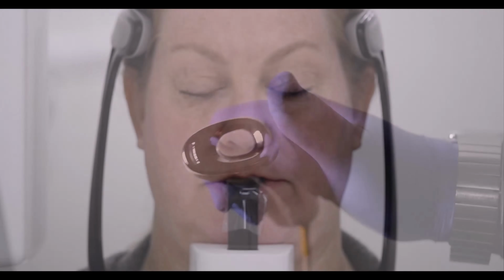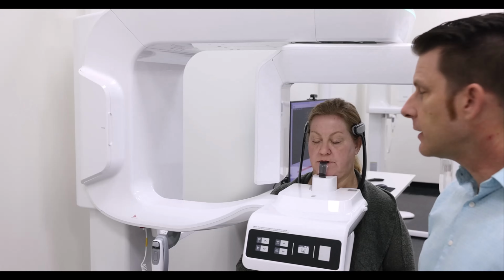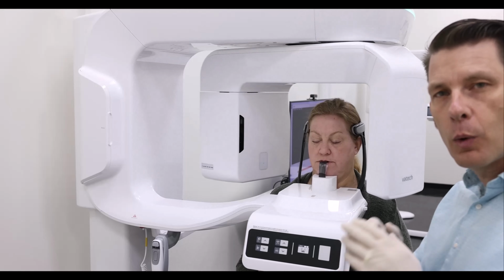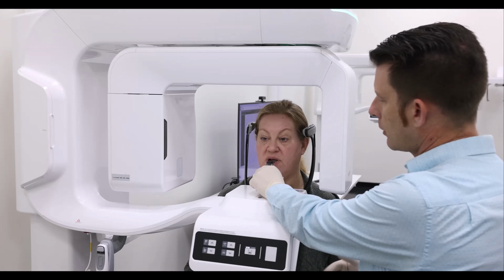Image capturing is complete. Please wait a moment. Once capturing has been complete, we can come back in and let our patient out of the machine once the temple supports open. Please open your eyes and follow the operator's instructions. Go ahead, open and go ahead and take a step back.